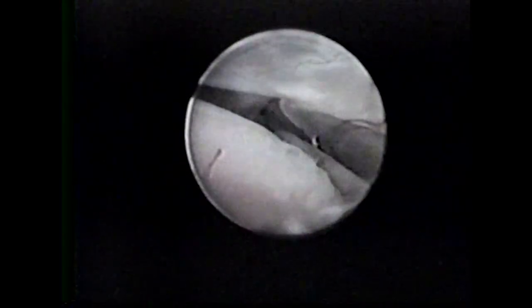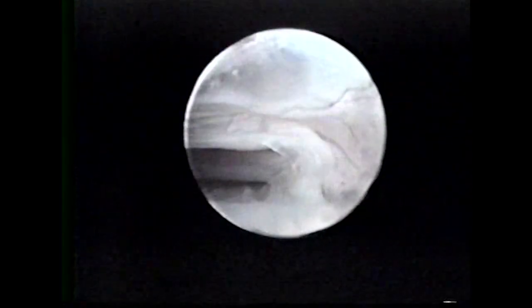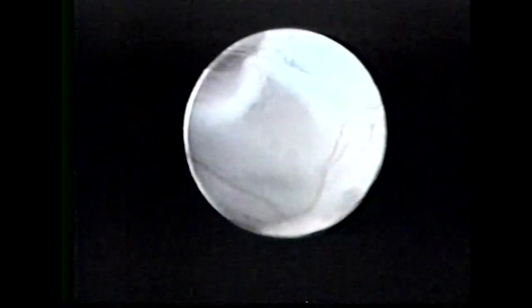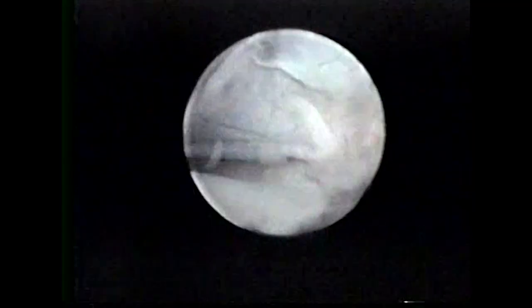One can see the relative amount of vascular markings apparent in these broad bands. Here, the adhesions are being wiped away from the articular eminence with a pulling and stroking motion of the probe.